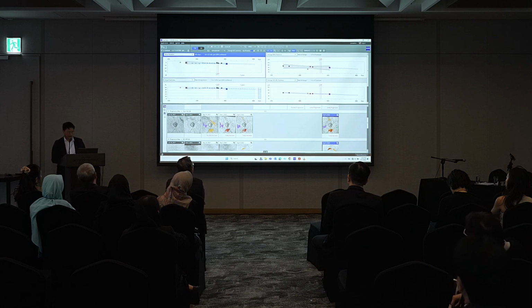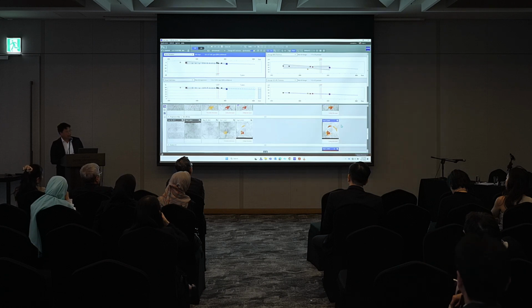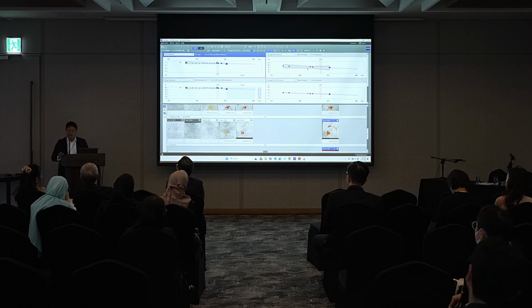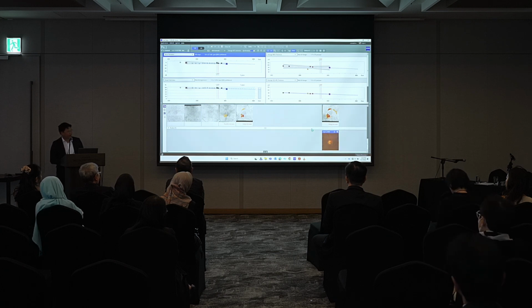So here's a patient that I really don't need to convince to say, hey, you know what, red is bad, okay? And basically, you're going to need something done. Here's your ganglion cell analysis, and it's all there for you. So, glaucoma is so simple, right? Like, everyone should be running their busy glaucoma clinics now that we've got Forum.